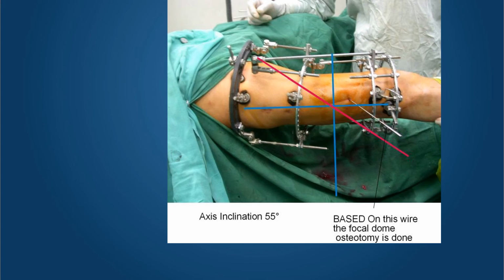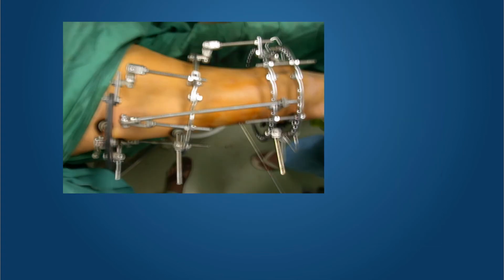At the top, towards the left, the red line that denotes the inclined axis is inclined at 55 degrees to the horizontal, and you can see the posterior hinge is very much distal and the anterior hinge is very much proximal. The rod on the medial side is the one in the concavity, which helps us to correct the oblique plane as well as the rotation at the same time. The osteotomy is done in an inclined plane based on the wire, which you can see shown by an arrow and a thin black line on this figure.